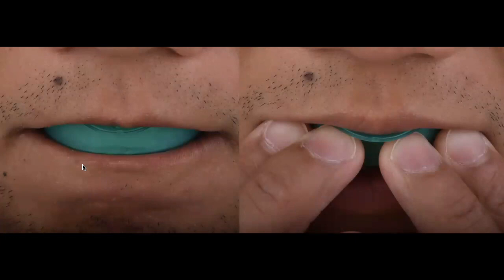Once they do that, you go to the third step, which is now with gentle pressure, you want them to put some pressure on the facial aspect of the tray, buccal and facial aspect of the tray. This is so that the gel can touch the tooth, have more intimate contact with the tooth, and at the same time, disperse slightly over the incisal third and middle third of the tooth.